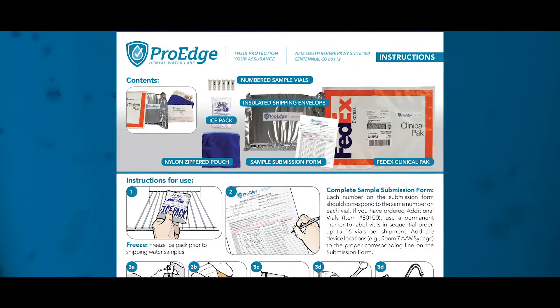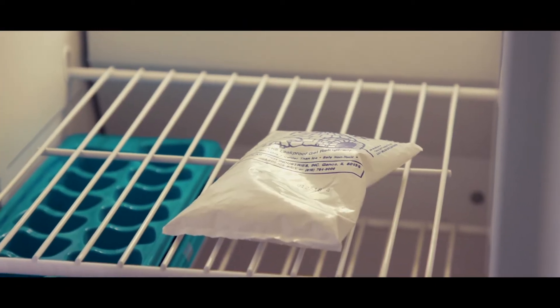Looking at our instructions, step one is to freeze your ice pack. It's easiest to do this the night before you take your samples. A frozen ice pack helps keep your samples viable during the shipping process.